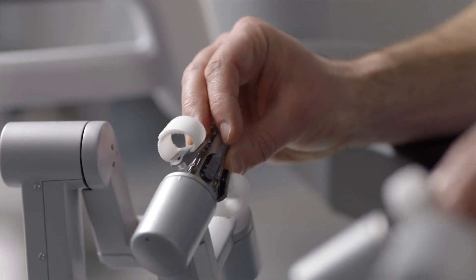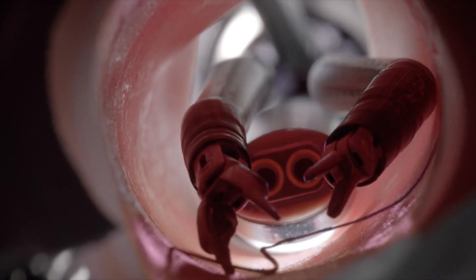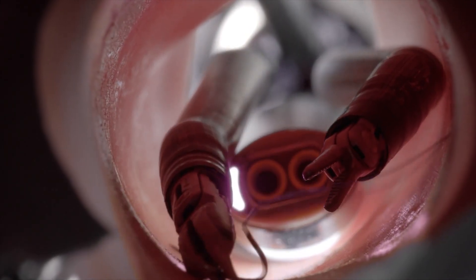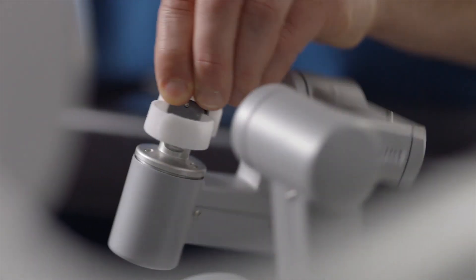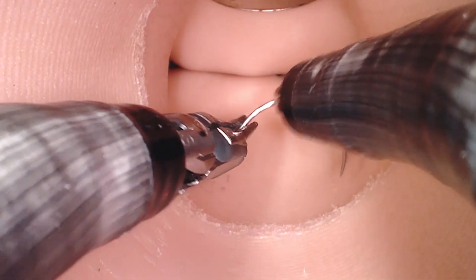Surgical robotics is a new technology that allows surgeons to extend their abilities to work in a more confined space with more precise movements and much better visualization.